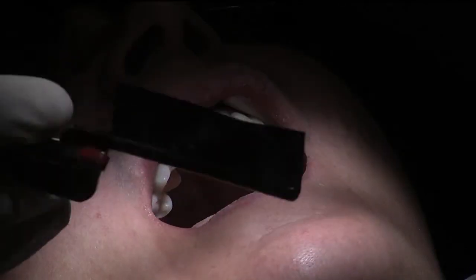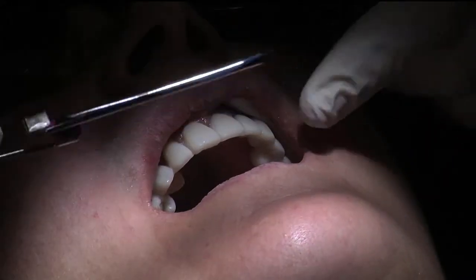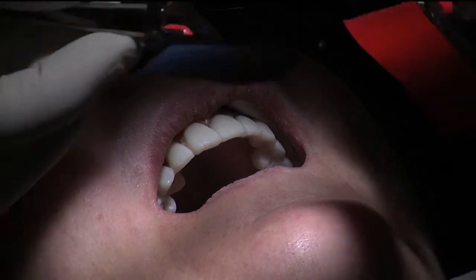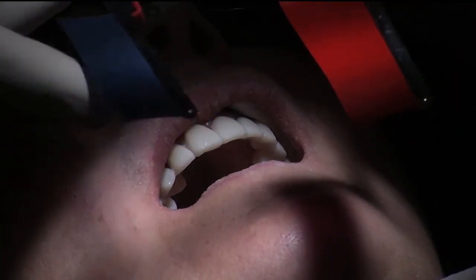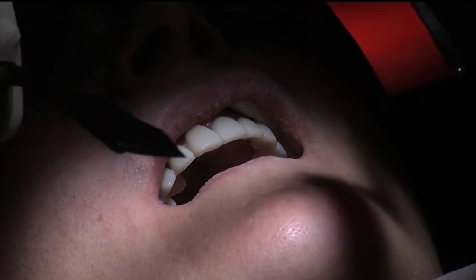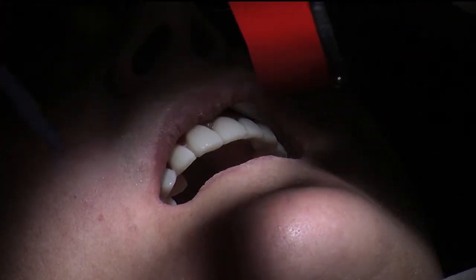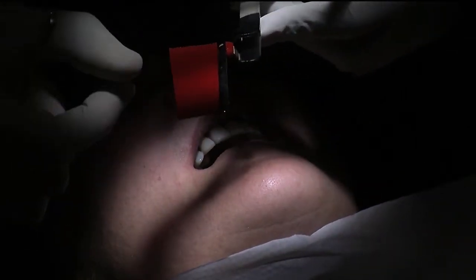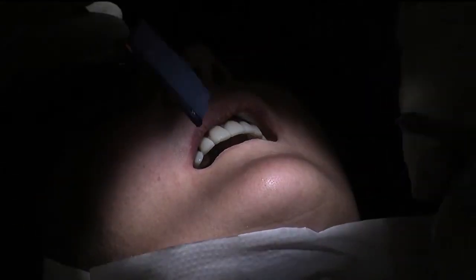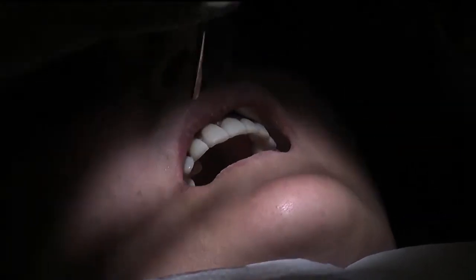I'm going to start checking your occlusion, having made some minor aesthetic changes. I'm going to use two articulating papers. One is this thick blue one, which is a Bausch 100 micron thick paper — it has something called a transculase bonding agent in there. The second one is a thin one, about 8 to 10 microns thick, a red one. It's a very clever system called a two-phase articulation system.